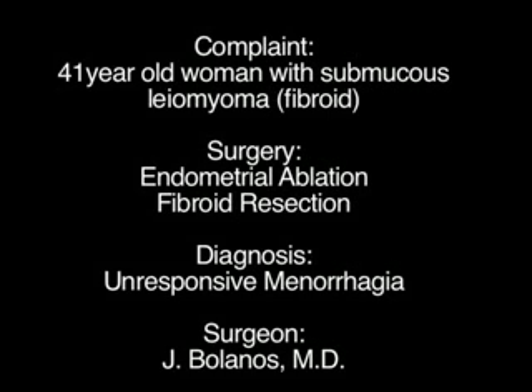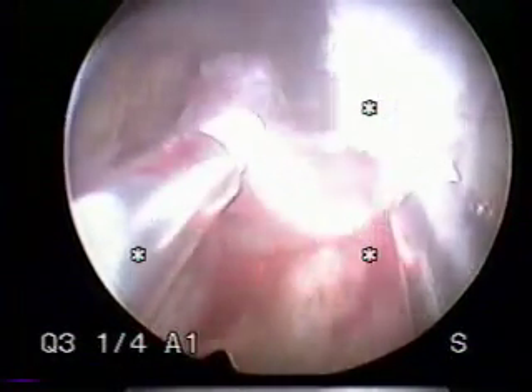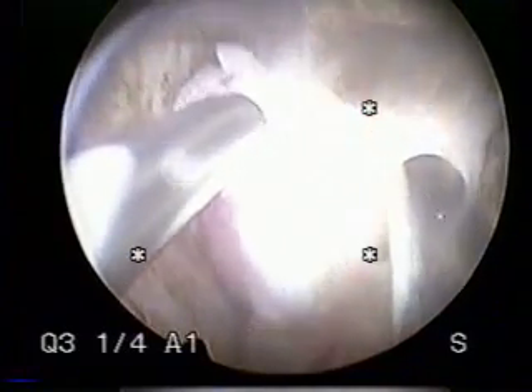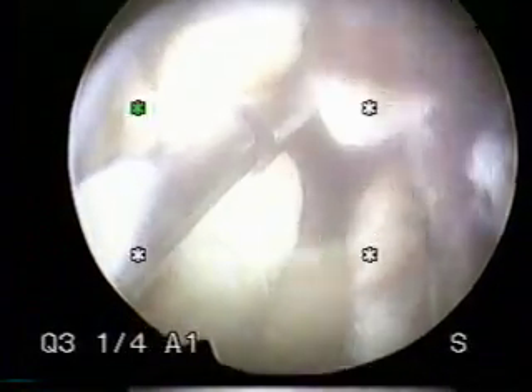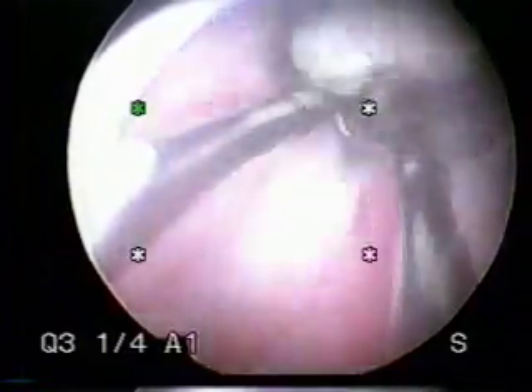This is a 41-year-old woman with a submucous leiomyoma, or fibroid. This is an operative hysteroscopy, and this procedure allows us to show you a new instrument — an electrical loop with electrical current that allows the removal of segments of this fibroid tumor. The fibroid is muscular tissue that is abnormal but benign, not cancerous. It causes a lot of excessive bleeding in many patients and is a very common cause for hysterectomy due to unresponsive uterine bleeding. The operative hysteroscope allows us the opportunity of avoiding hysterectomy by controlling these conditions of excessive uterine bleeding.